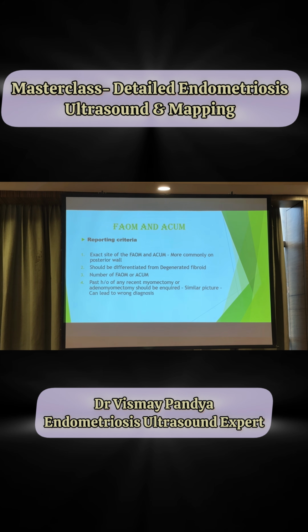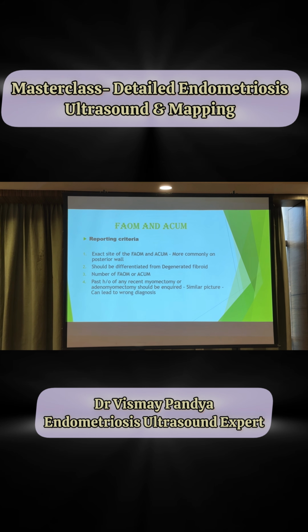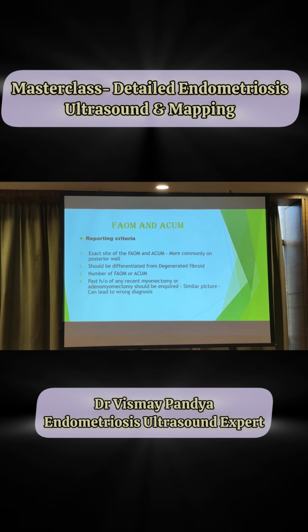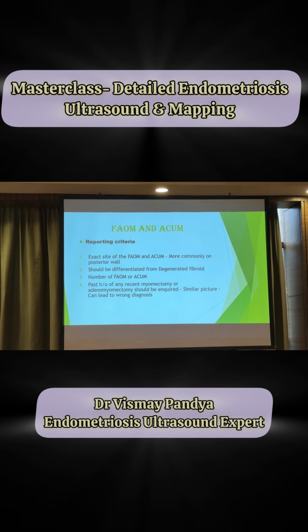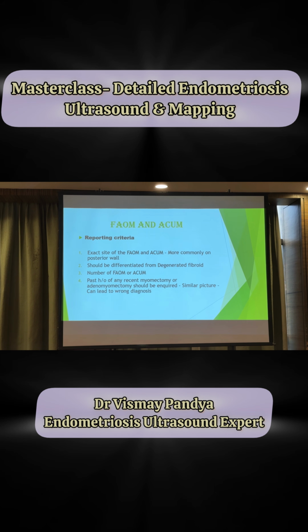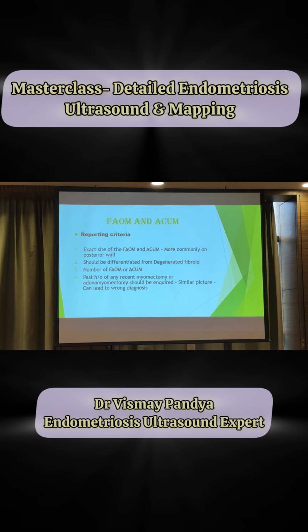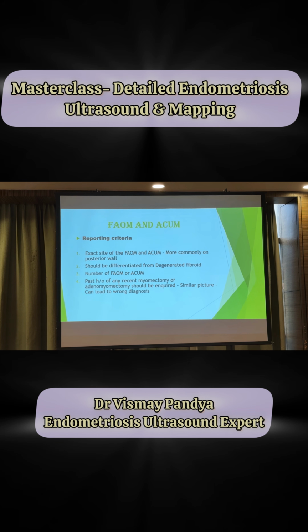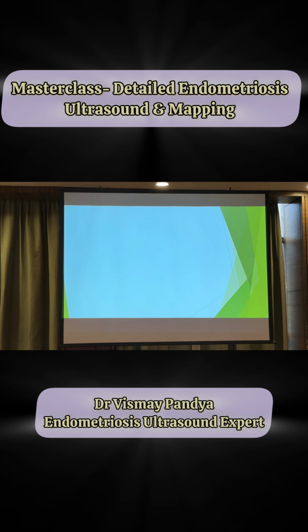And yes, one more point: we are also getting recent cases of operated adenomyomectomy and microwave ablation, which radiologists are not very much aware of. Any recent myomectomy or adenomyomectomy can also look like an ACUM, and they are wrongly diagnosed as FAOMs and ACUMs. They come to us and we do a re-diagnosis, and tell them that this is not an ACUM or FAOM, it is just post-surgical findings.